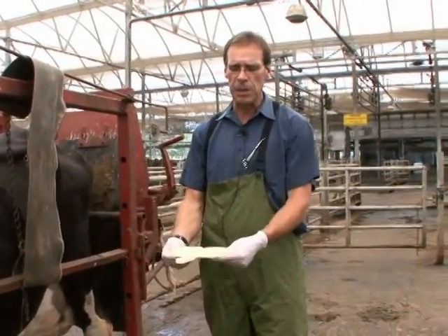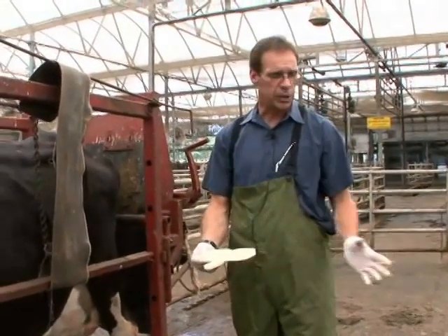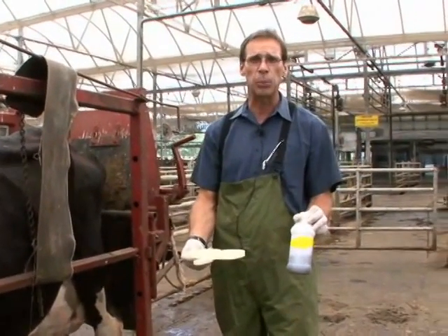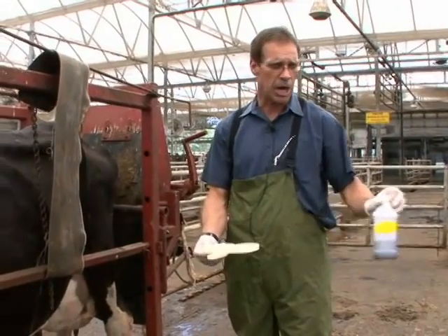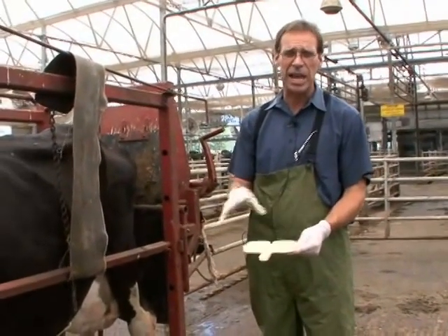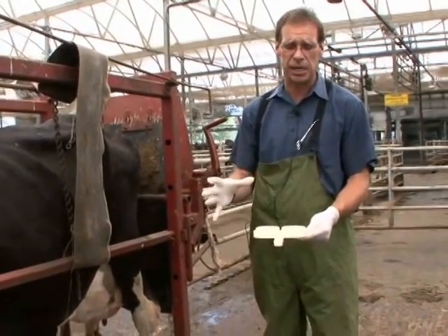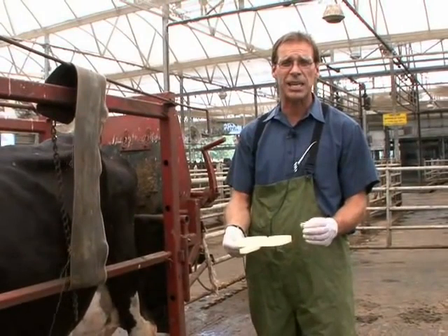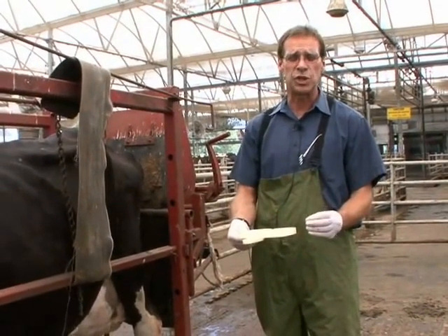Once we retrieve milk from these cattle, we add a reagent which looks like this. It's typically purple, and it contains different compounds, one to test pH, and the other compound will actually lyse the white blood cells, releasing their cellular contents, which typically is very tacky, and they want to stick to each other.